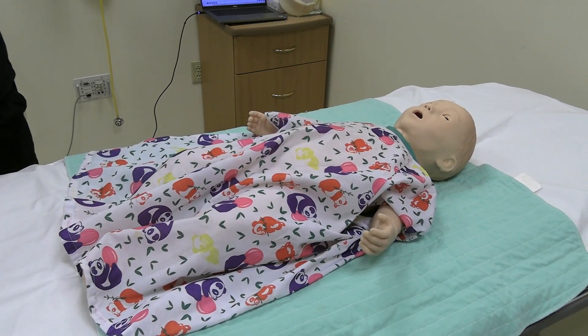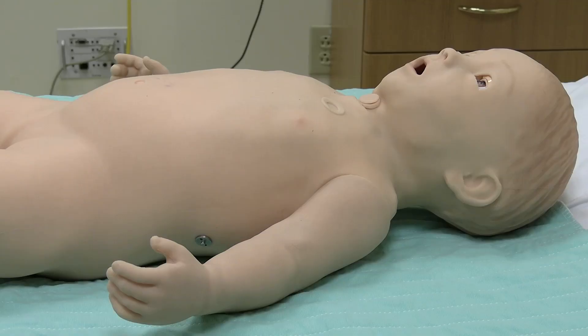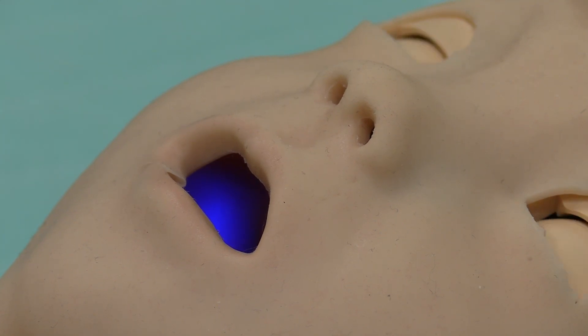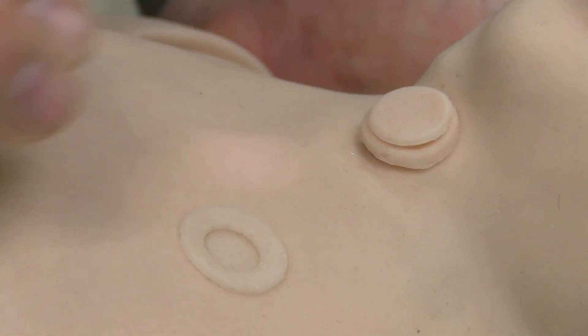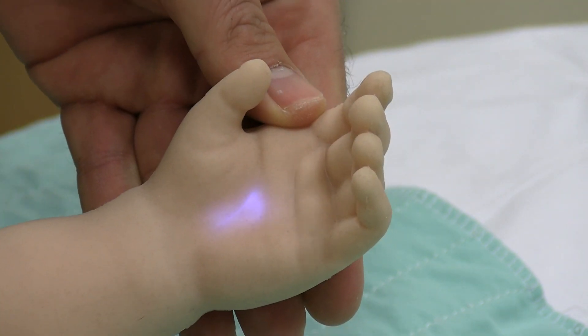SimBaby breathes displaying chest rise, has pulses, and blinks opening and closing its eyelids. His pupils also dilate, constrict, and react to light. As the oxygen saturation levels drop, cyanosis will display with a bluish hue appearing around the baby's mouth, lips, and cheeks. Capillary refill can be demonstrated on the upper chest along with the left hand displaying a subtle white light.